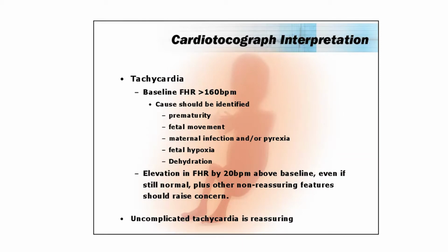So I would always urge people to question, before you put a CTG on a very preterm infant, ask yourself the question before you put it on: what am I going to do if this is not okay? You always do it to check if the baby's okay. But what happens if it's not? Don't ask yourself that question when you have the tracing that's not okay. Ask yourself that question before you decide to do it, because it's a very difficult position to be in.